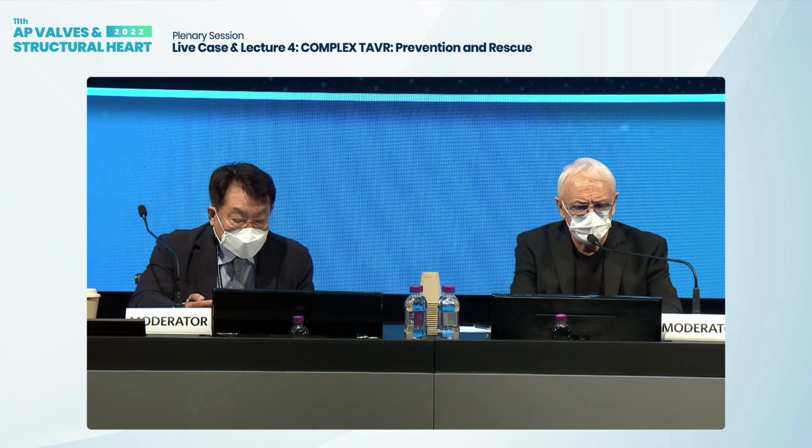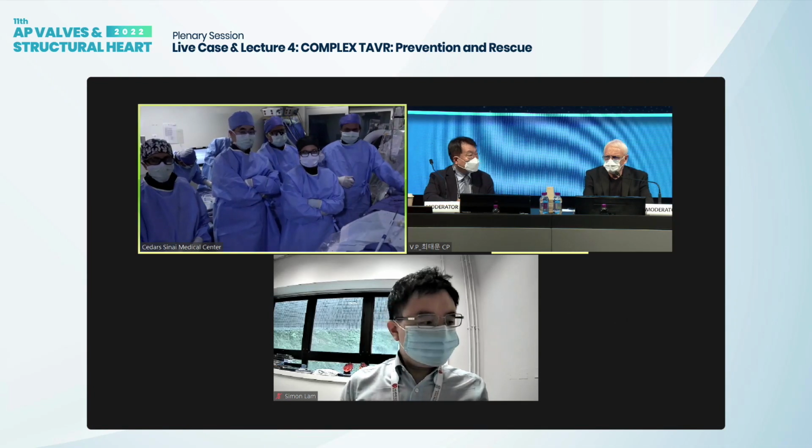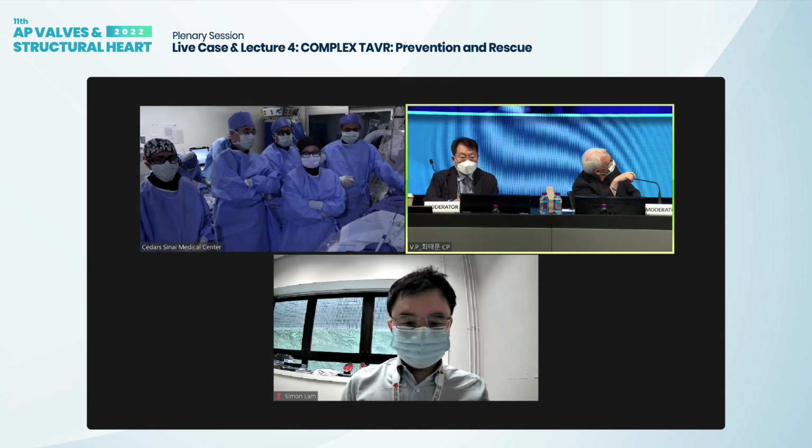So we are transmitting from Los Angeles, from Cedars-Sinai. I guess we're looking at some cases with bicuspid aortic stenosis.